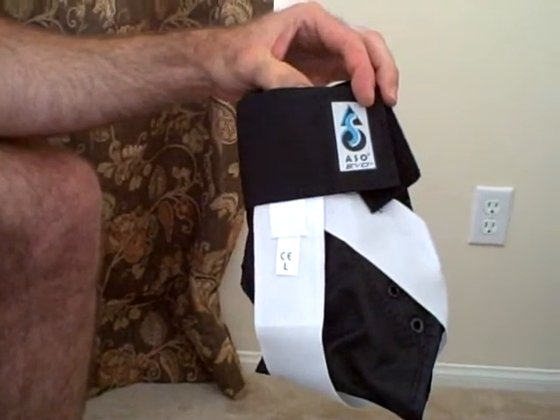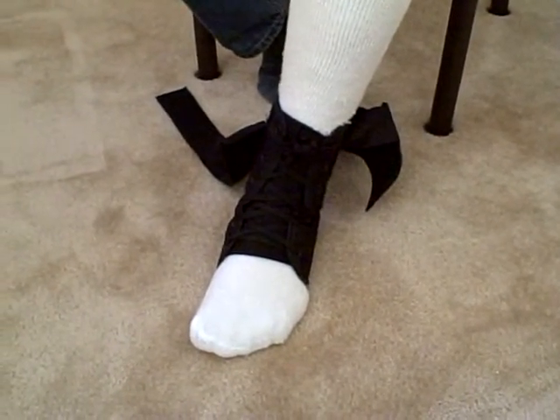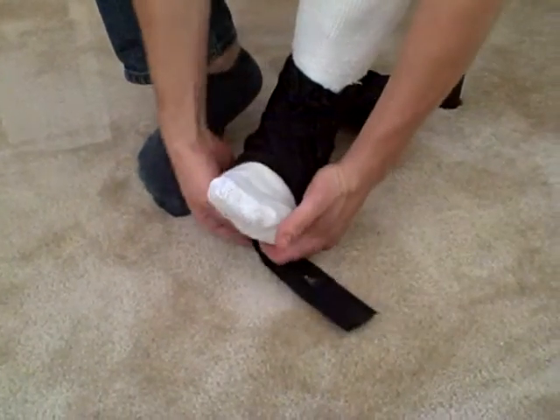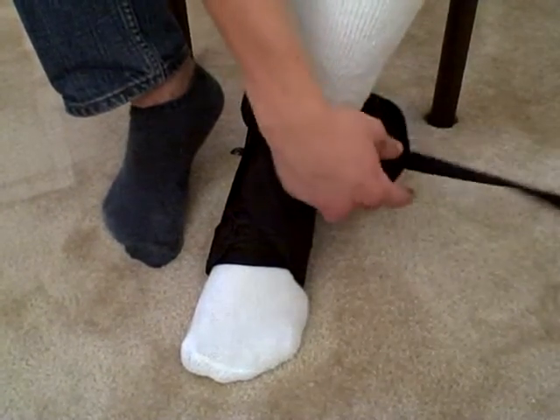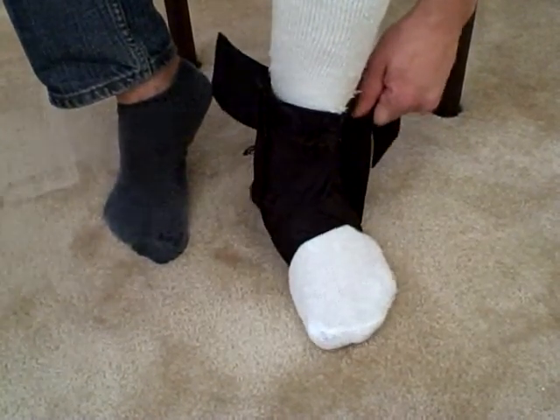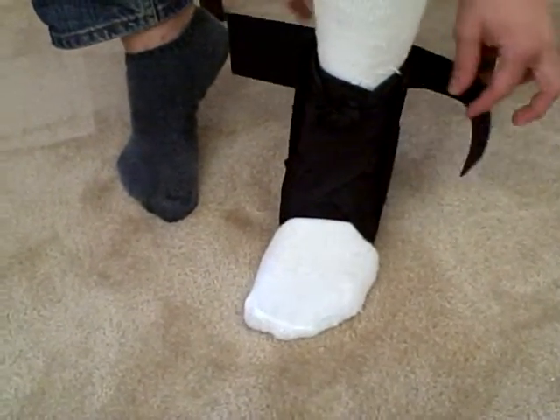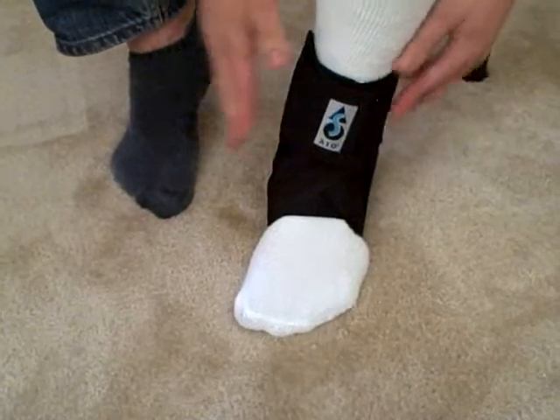Down below, I have a new black ASO Evo that's already to be strapped up. It's already been laced so you can see it's a fully black brace. We're going to lace up with the figure eight straps — putting this inside strap on first, pulling it up tautly and applying it to the inside top portion. Then we take the opposite strap, which is actually more important, and make sure it's flush against the ankle. We pull it up, attaching it to the lateral side of the ankle. From there, we use our elastic closure cuff, which secures off the front of the ankle.